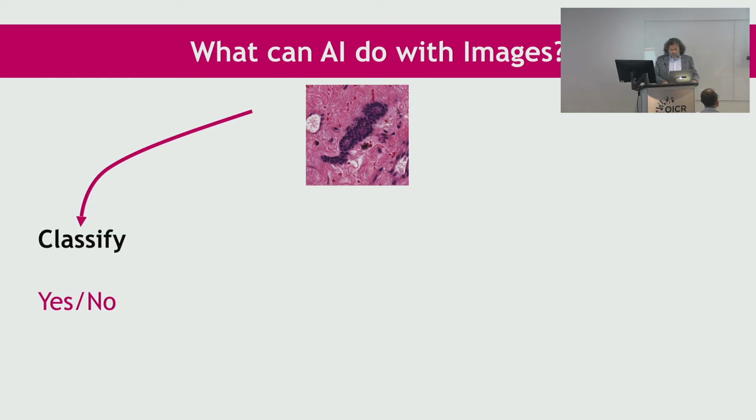So one of the things that we can do with digital pathology images, definitely we can classify them, and the absolute majority of papers are doing that. And that's fundamentally a yes or no decision. So yes, it is malignant, no, it is not malignant. That seems to be very popular, at least with computer scientists and engineers.